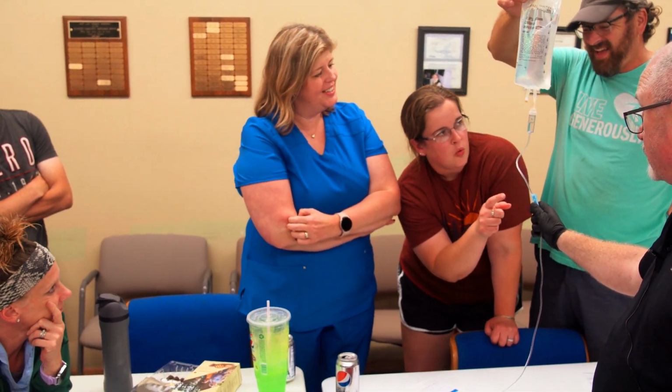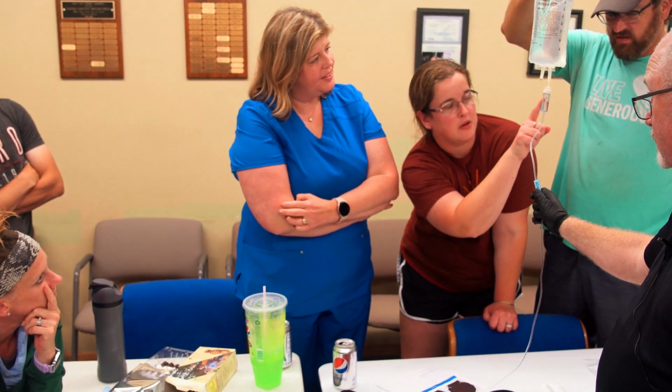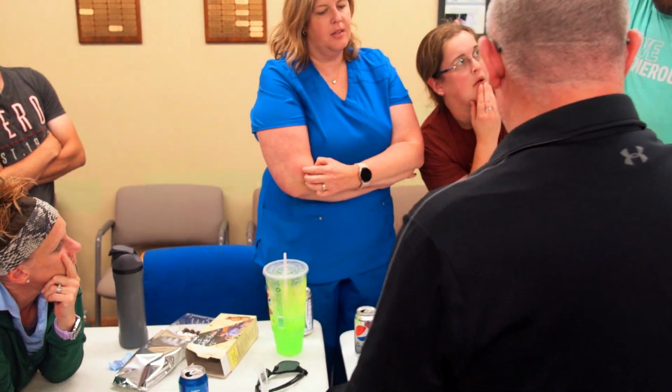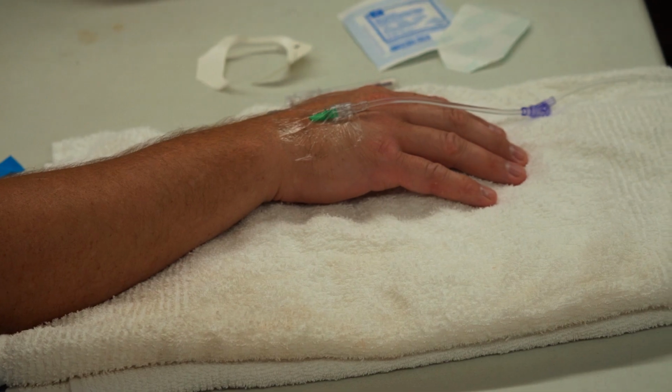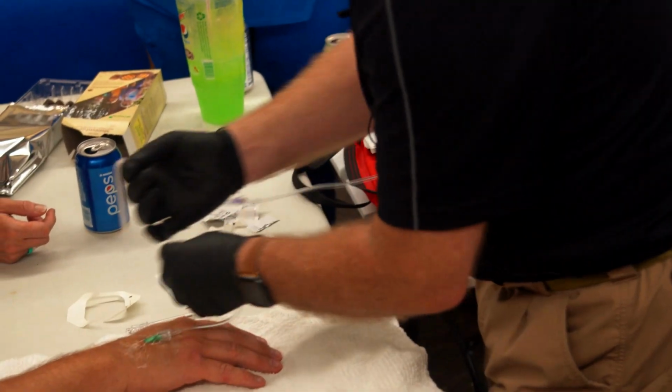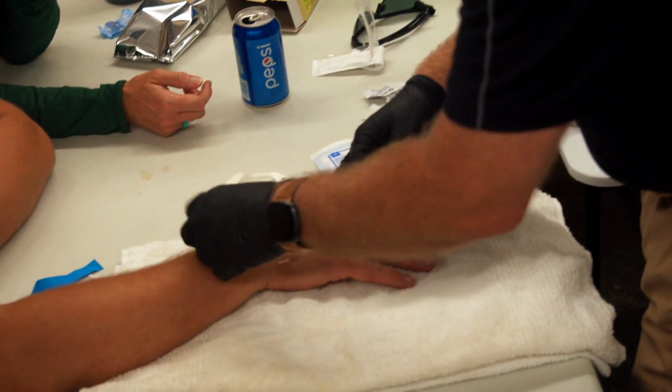So wherever this is gonna determine the drip rate, not necessarily, I suppose it's both, and the flow rate. Your drip rate right now is 0 drops per second. So if we do about 1 drop per second, let me roll this up here. 1,000, 2,000, so about 1 drip a second is going to be about 6 mils a minute. If I do 1 drop a second, that is 60 drops, which is exactly 6 mils a minute.